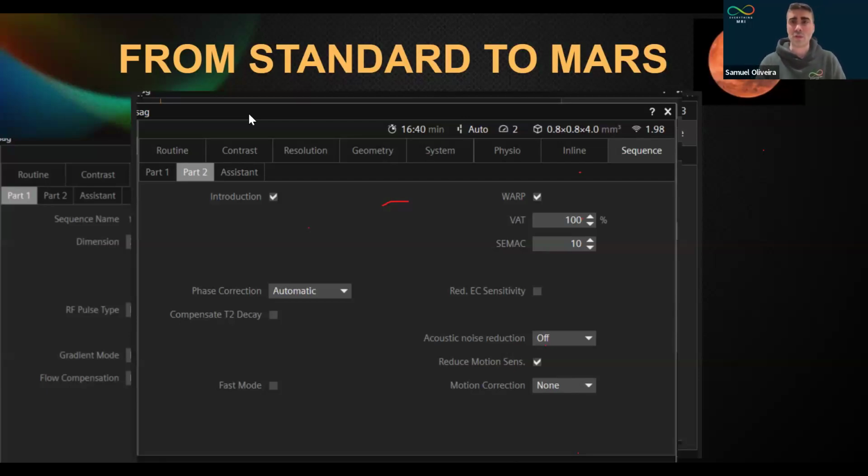Of course, there are new things coming out like Nordinsight. They are partners of Everything MRI as well. They have this database, and they use AI to search implants. So there's loads of material out there that you can use. I wouldn't focus on one source of information. And if you have to base yourself on one source of information, I would base myself on the national guidelines of your country. That would make it easier. So just to be unbiased, of course.